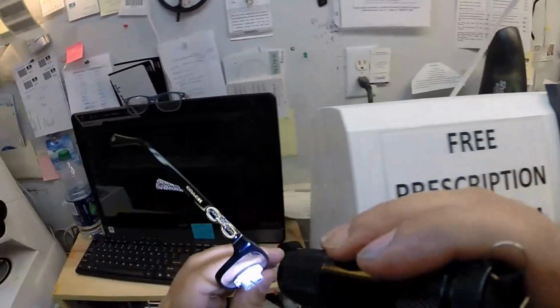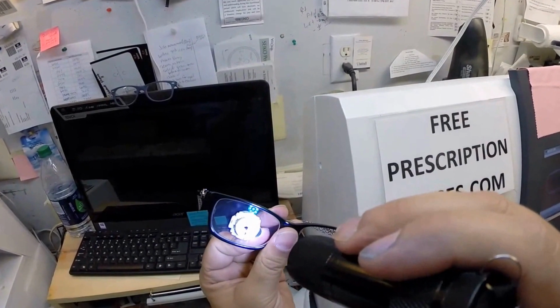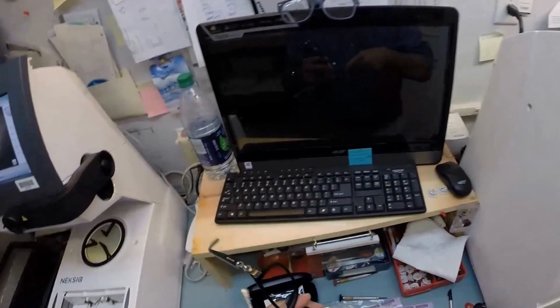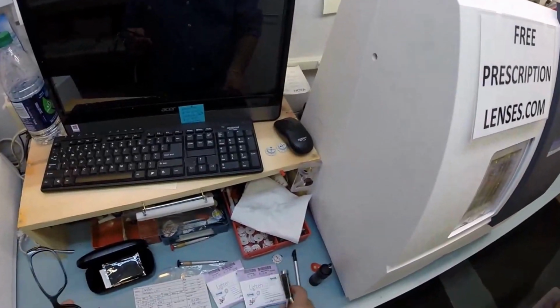This plastic frame does well with your prescription, or even stronger than that, this would be a great choice for that. But while the left lens is cutting, let's go ahead and take this block off. It is no longer needed.